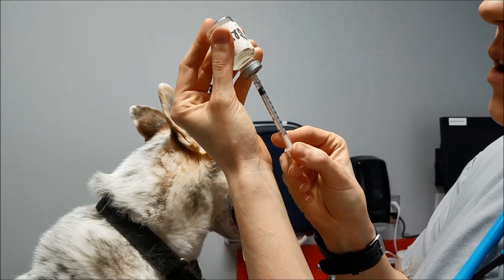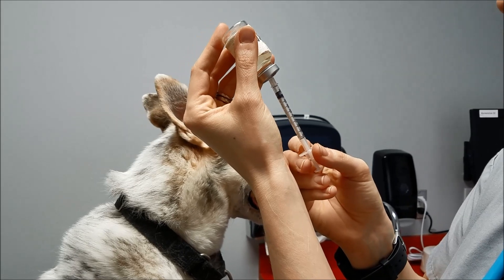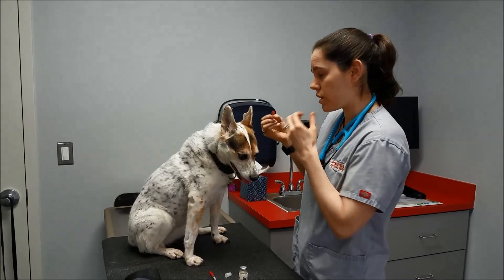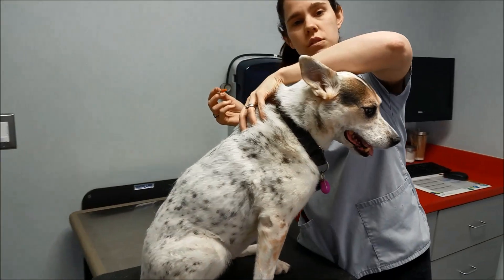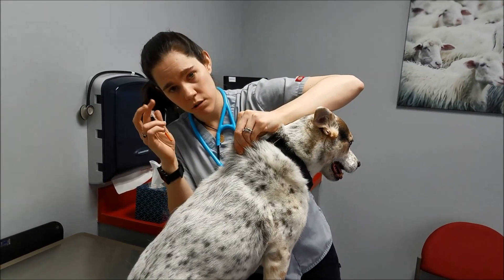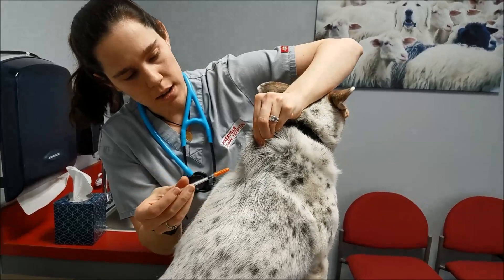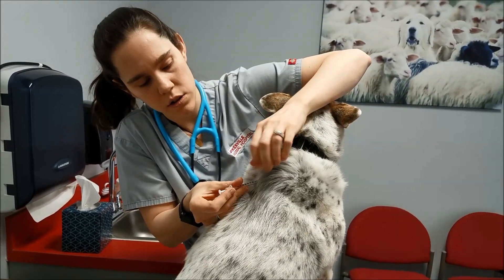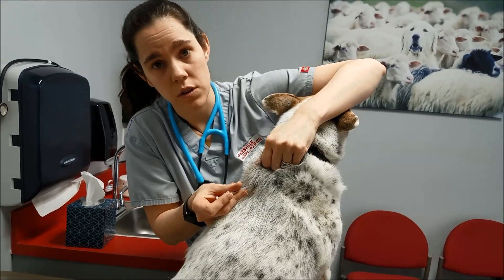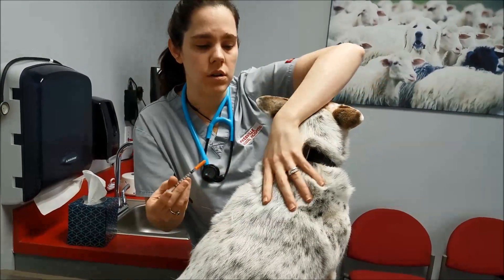You pull it up to your desired units. Let's say she's getting five units, so we'll pull it up to the five. Basically we're gonna use this area back here, because this has a lot of extra fur. What we want to do is tent the fur — you pull up on it, see how she's got all this extra skin there. You're gonna go pretty much parallel to go into that skin area, so then we know that it's going into the subcutaneous region. You pull up, go in, press in, and then your insulin goes in the subcutaneous area.